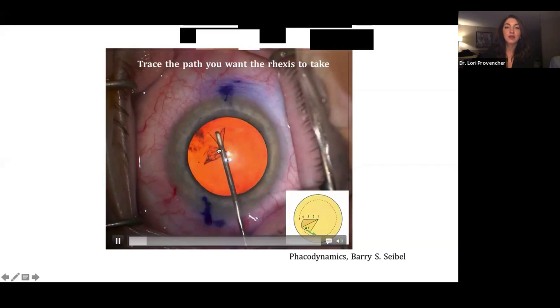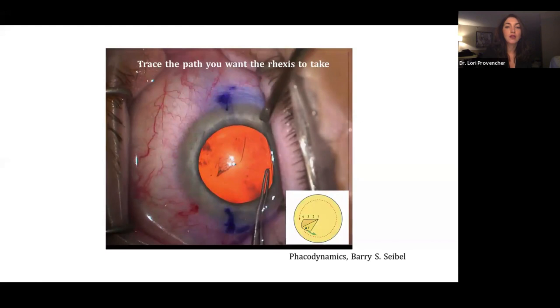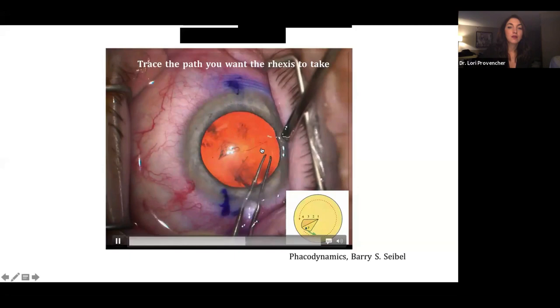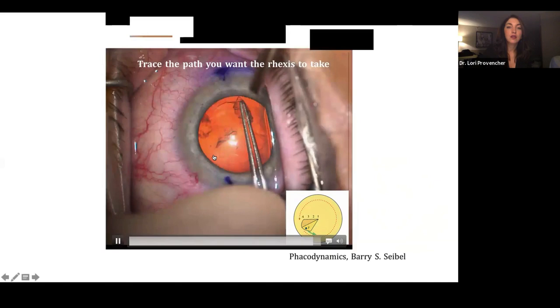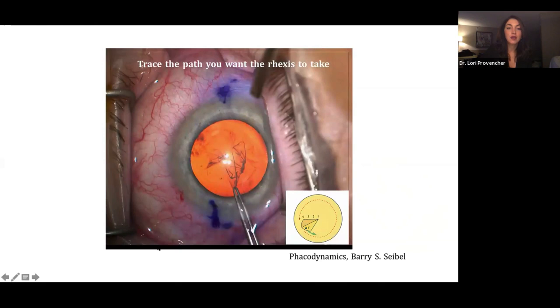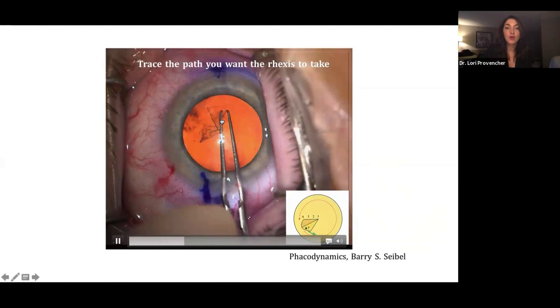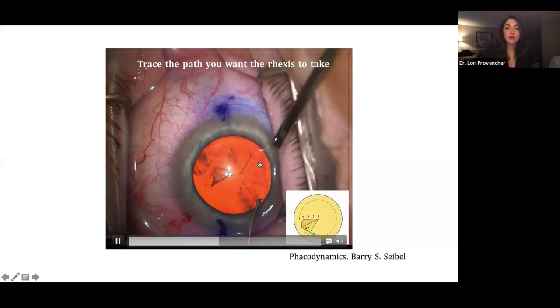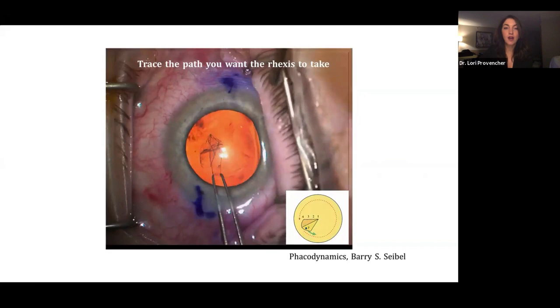I'm setting the length of the rexis with the cystotome here. And then I'm going back in. And as the flap is folded over, I'm actually focusing at the tip of my utrata more than I am at the area of the tear. I'm not looking so much here. I'm actually watching where this is going because I'm tracing the path that I want the rexis to take. And this works really well if you have a stable chamber and the flap is folded over properly.